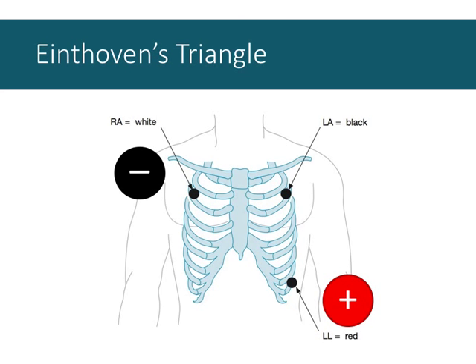It corrects the signal we observe between the positive and negative electrodes so that any extra noise is removed. It's outside of the vector. It shouldn't pick up any electrical activity. It's usually placed over bone, which is not electrically active. And so any residual activity of the signals on the wires, or friction of a person on the chair, or movement of their feet, or any residual activity in the tissues of their body is accounted for by that ground wire.